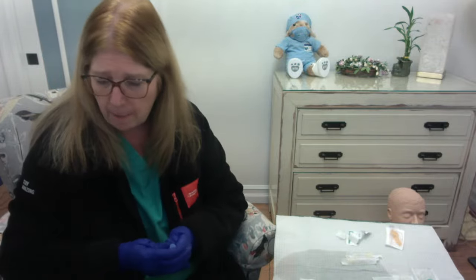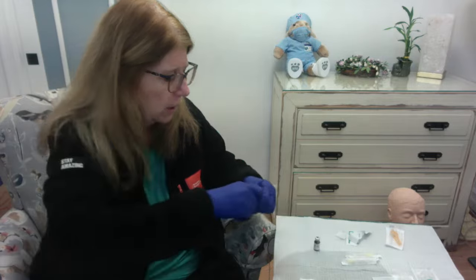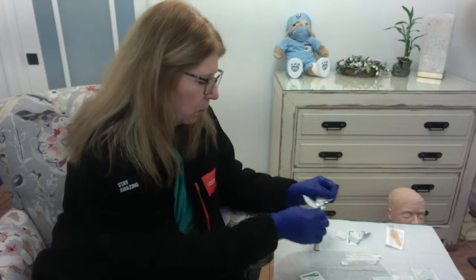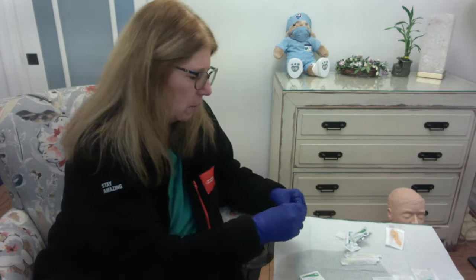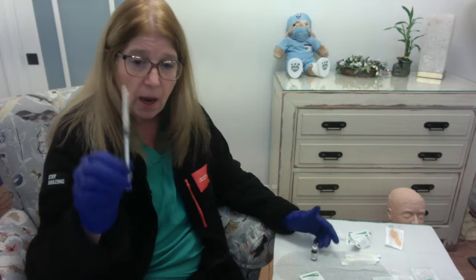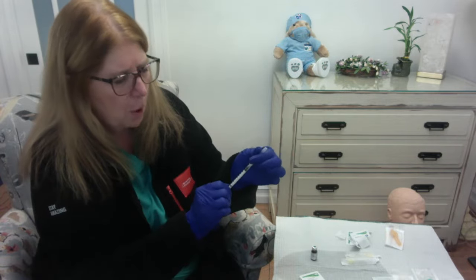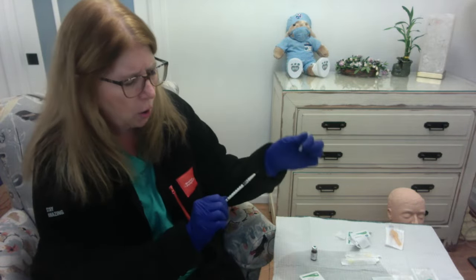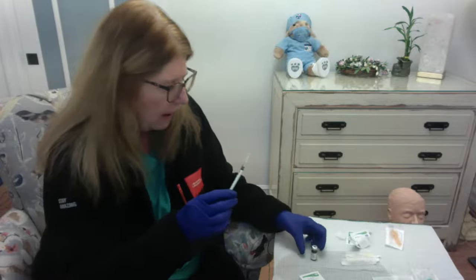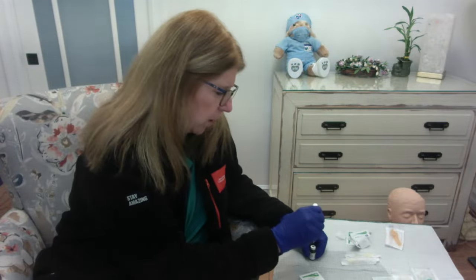We'll take the cap off, and then of course we have to clean it again with our alcohol for 30 seconds. Okay, get that nice and clean. We're going to take our tuberculin syringe, take the cap off, and remember it's just a pull off, don't twist it off. I have my air drawn back already from my 0.1.